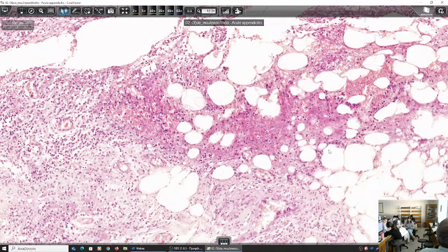So, what else? How else will you become sure that this is acute appendicitis? Apart from the clinical evaluation, what will you ask for? Ultrasound, but first the easiest thing to find is what? You'll have the general examination of the blood, because what will you find?